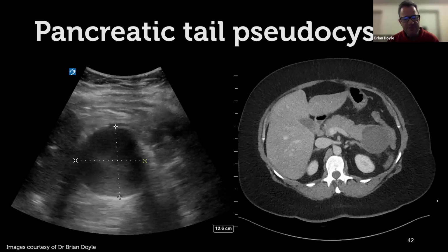The gallbladder looked okay. She was really tender, and I just continued to scan along, scanned a bit of the spleen, and found this mass between the inferolateral pole of the spleen and the left kidney. Honestly, I didn't know what the hell it was. I just knew it shouldn't be there. I felt rather dumb at the time, to be honest with you. I felt rather humbled and wasn't sure what exactly I was looking at, and ended up getting the CT as a result.